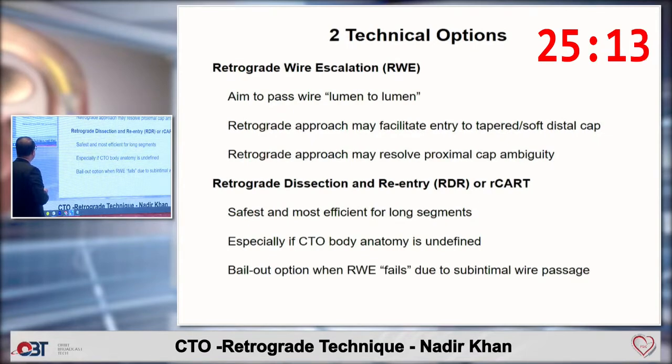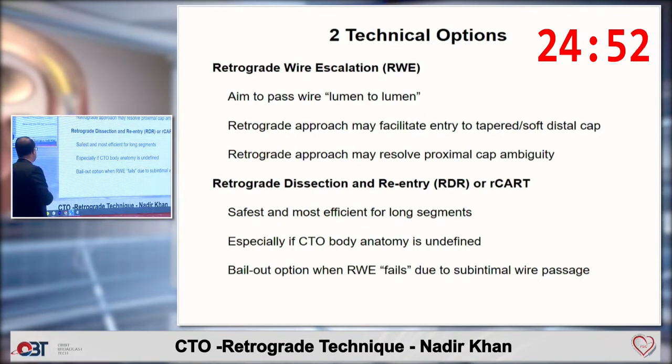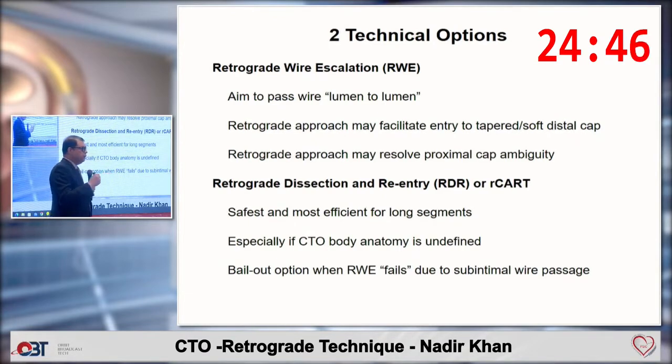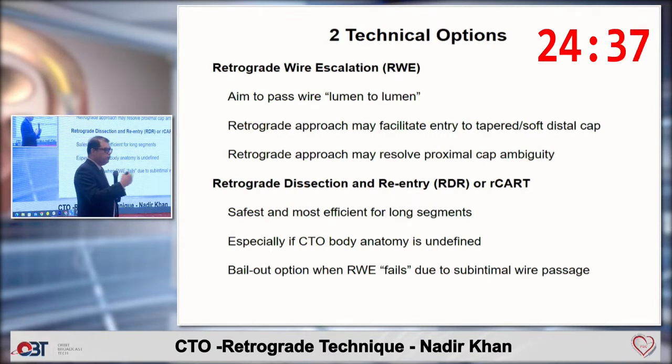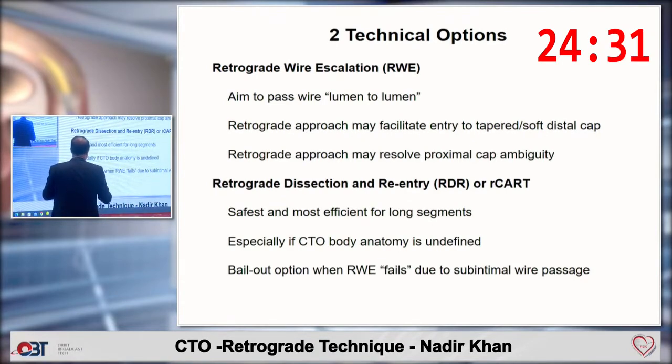Now, once you do the retrograde wire escalation, you want to pass the wire from lumen to lumen, no subintimal tracking. This is probably the ideal way of doing it, but most of the times you are not successful. In that case, you do reverse CART in the body of the CTO. You try not to go subintimal in a normal vessel. Try to be subintimal only in the body of the CTO because it's already occluded. Otherwise, if you go proximal or distal subintimal, you can lose side branches which come in the way of that particular area.